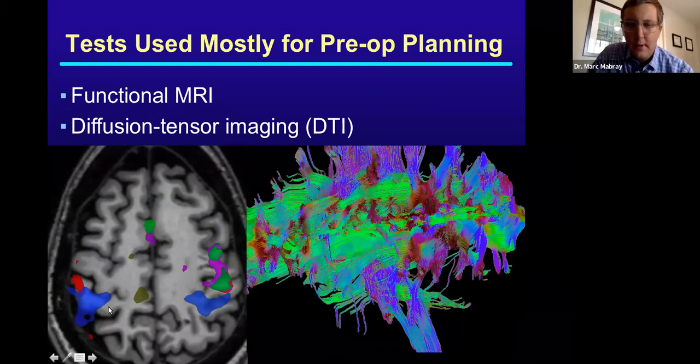So this image or 3D volume of information can be registered to the patient in the operating room by using a fancy computer navigation system. So for example, they would touch a probe to the nose and register where that is on imaging, and then the ear or a few different landmarks. And they can basically know and project on the image that my probe or instrument is right here. Now it's here, and now it's here.